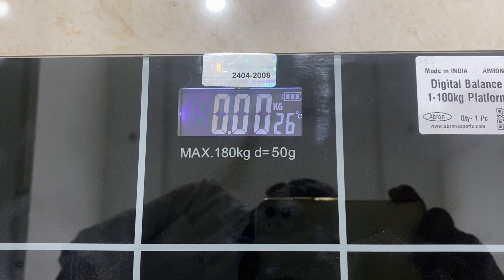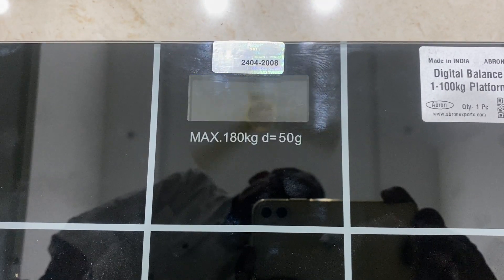This can be used in the lab for putting your balances or weighing your items.